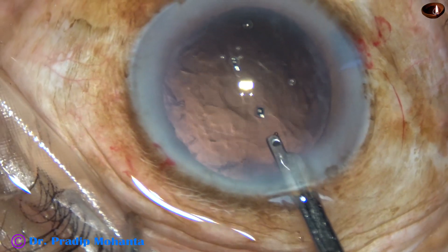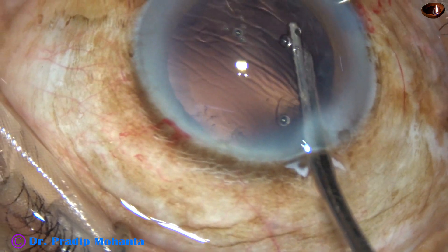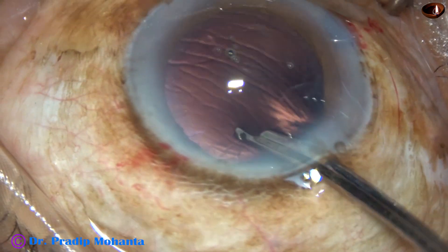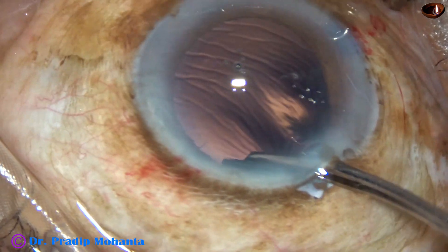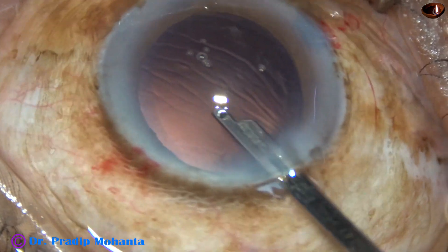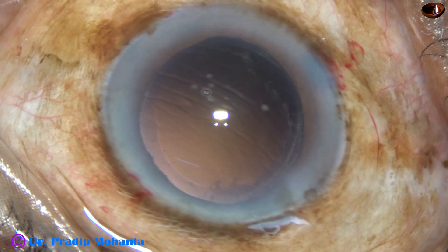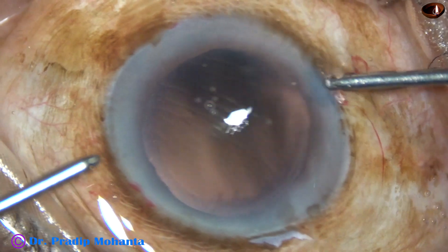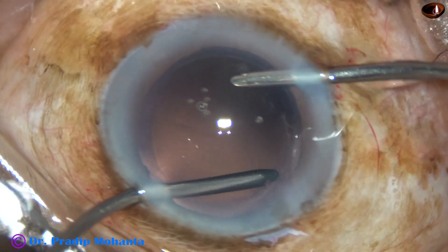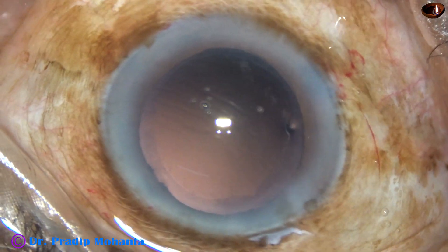Visco has been injected again. By the time my assistant gets ready with bimanual, she first offers me a 23-gauge Simcoe. With this instrument, I am removing the cortex from 1 o'clock to 8 o'clock. And now the rest of the cortex — I am going to use bimanual irrigation-aspiration. The irrigation goes through the right side port, aspiration through the left. Cortical cleanup is being done very nicely, including the sub-incisional cortex and the cortex from 9 o'clock to 12 o'clock.